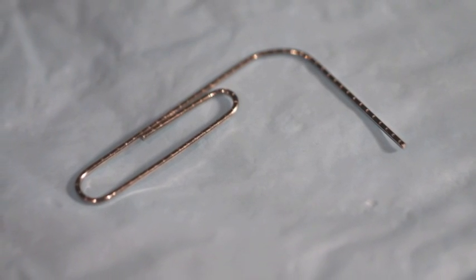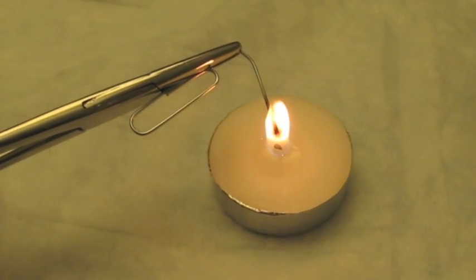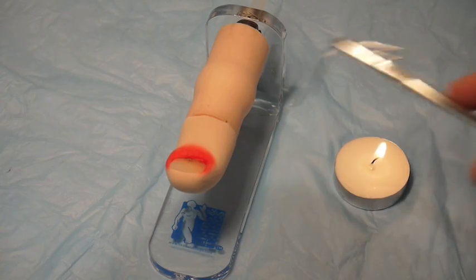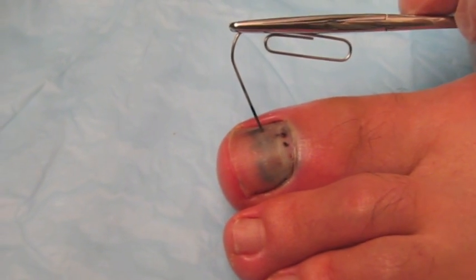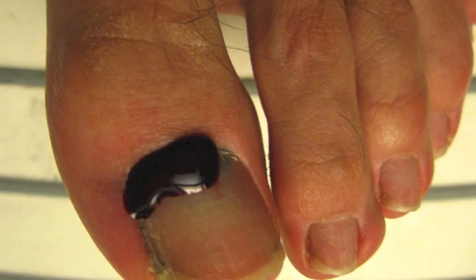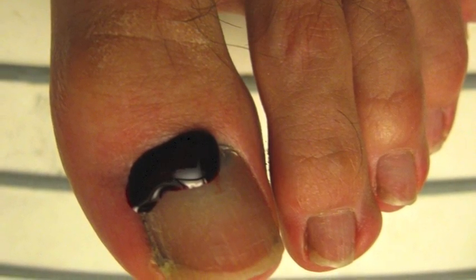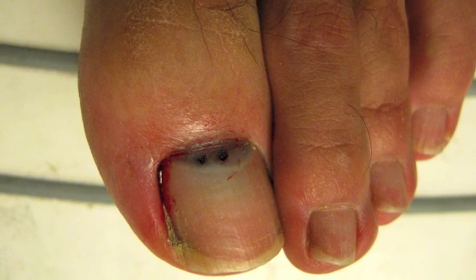If a paper clip is being used, heat up the end of the paper clip using a flame. Once heated, apply pressure over the center of the hematoma to melt a hole into the nail until the hematoma is reached and blood starts to drain out. Multiple holes may be needed to fully drain a large hematoma.